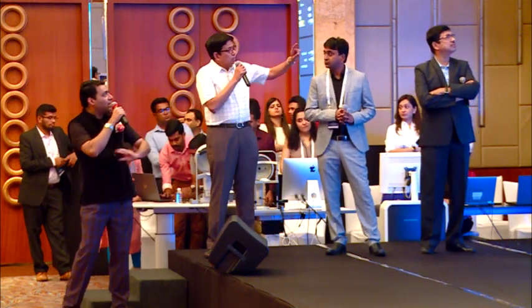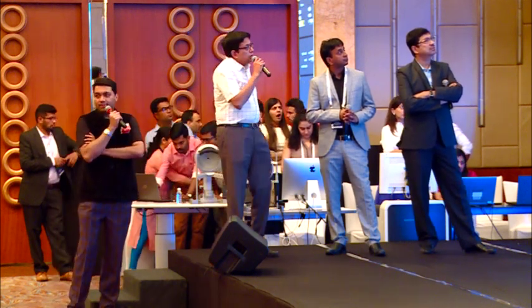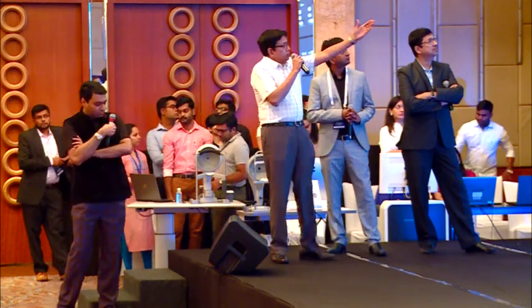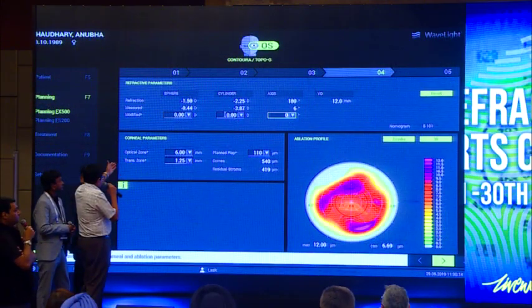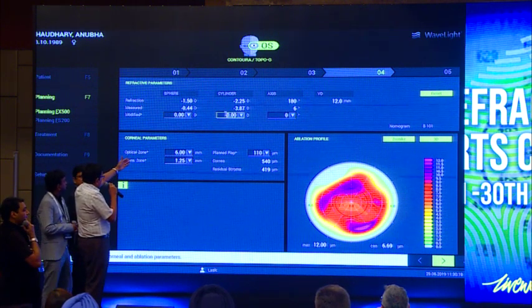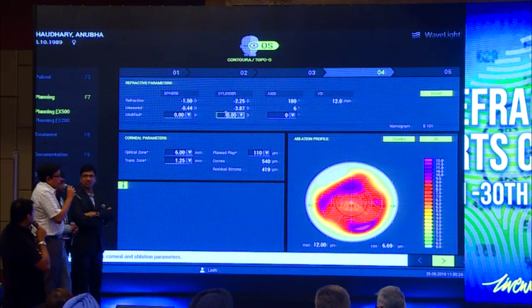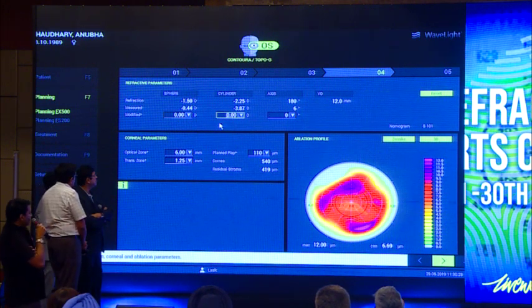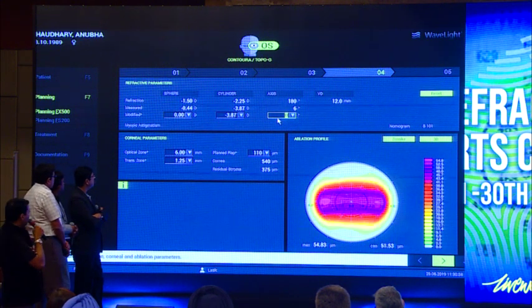Dr. Ramamurthy, how would you approach this? Keep it zero again. If you go by the classical teaching of how Contoura is to be done, you should simply go with 3.87 at 6 degrees, and then of course make a compensation for the spherical error. Take half the amount of the difference between 3.87 and the refraction. That's your TMR. That's what John Kanellopoulos studies. So can you just show what TMR is? Keep 3.87. Dr. Ramamurthy is going to explain the TMR, the topography modified refraction.